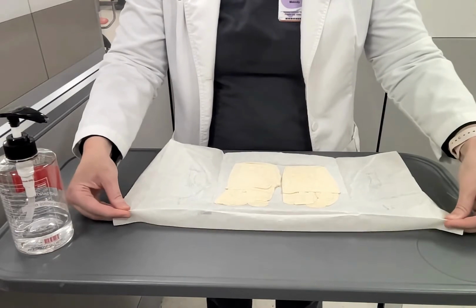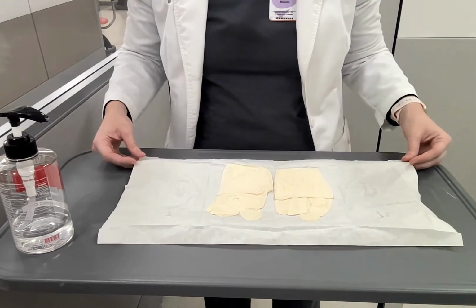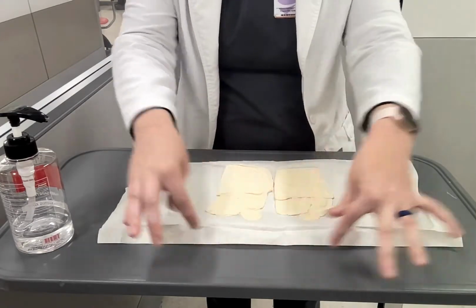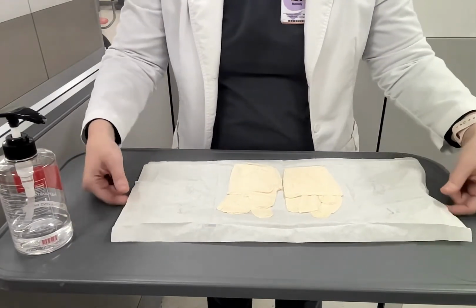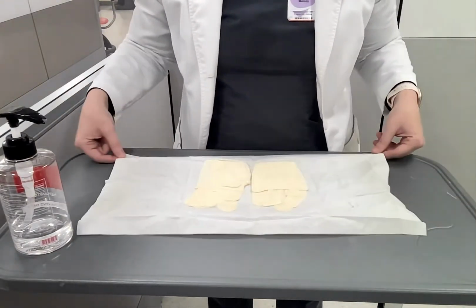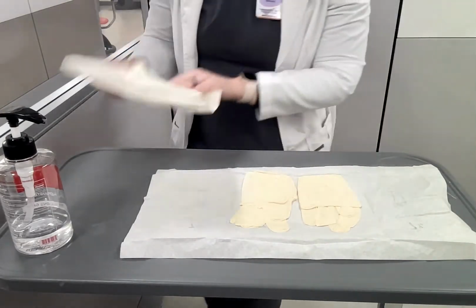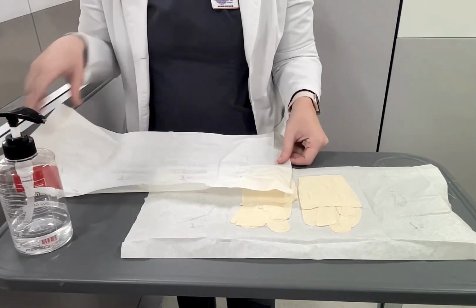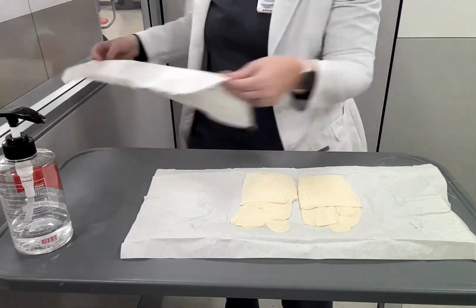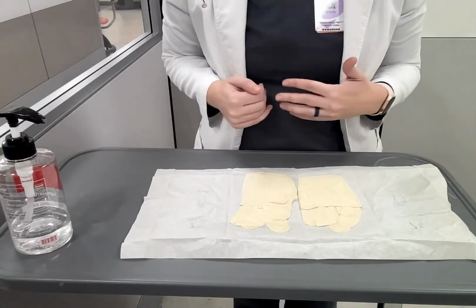I find it easiest to just pull at the edges here and bend it a tiny bit. Do not touch anything inside this 1 inch border. You can fix and fuss with all of this part, okay? If I want to move it up here, that's all fine and good. Also, don't be opening up other sterile fields on top of each other. You're placing a non-sterile onto a sterile surface, so get another table, have it close by, but don't violate each other. Here we go, outer 1 inch only.